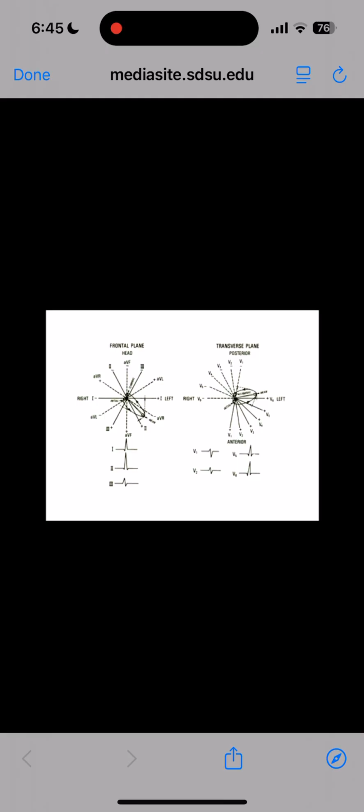Okay, so I'm going to move on and talk about the things that we should be able to determine from an ECG. There's 4 things. Number 1 is going to be the heart rate. Number 2 is whether there's any arrhythmias, which is any type of irregular heartbeat. Conceptually, I'm going to walk you through how we could determine whether there's a myopathy, which is damage to the heart wall. And then actually, they can tell whether there is damage to the conducting system, which is the pacemaker cells. And I'm going to give you one example of that.